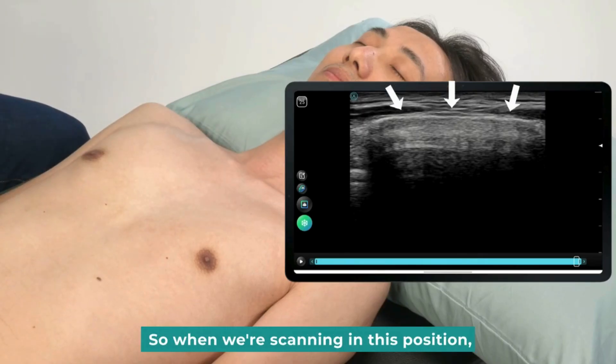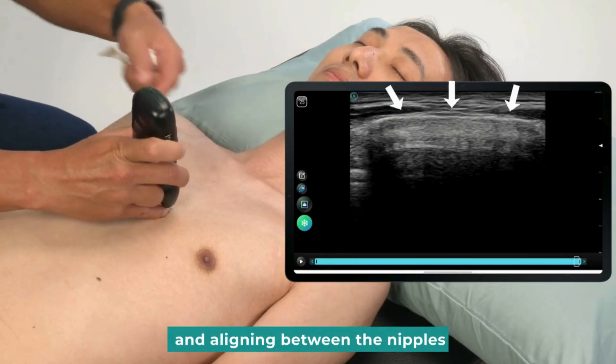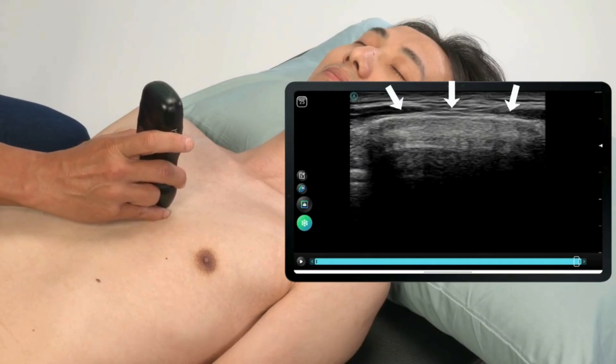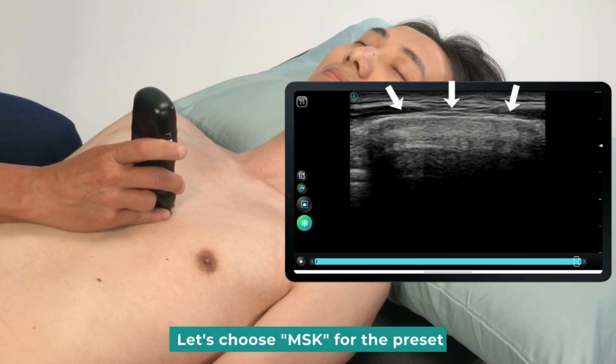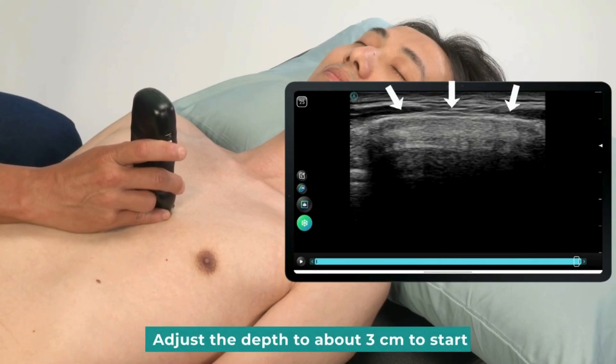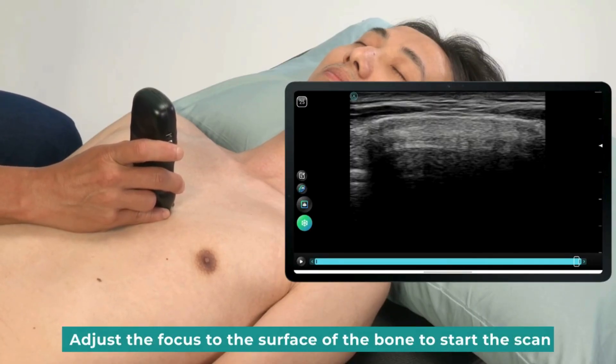When scanning in this position, we can place the probe in the middle of the sternum, aligning between the nipples. Place the probe horizontally. Let's choose MSK for the preset. Adjust the depth to about three centimeters to start. If necessary, you can adjust settings on this device. Adjust the focus to the surface of the bone to start the scan.